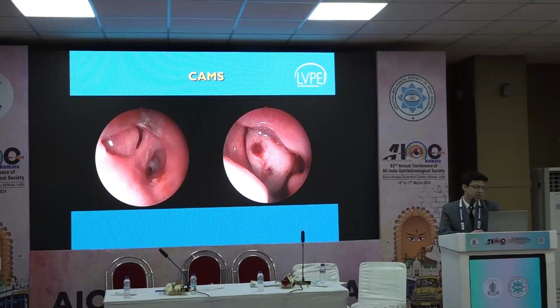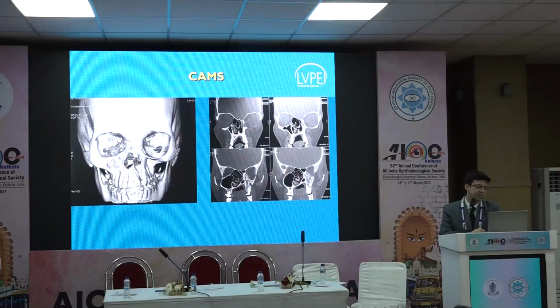So when you look endoscopically into this patient's nostril, you can see on the right side, that's the right nasal cavity. In between is the septum. And then on the left side, the nasal cavity is not well developed. And the largest structure you see on this side is the concha bullosa. That's a large middle turbinate on the right side.